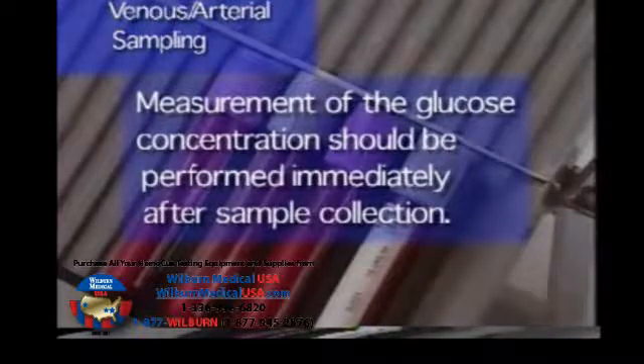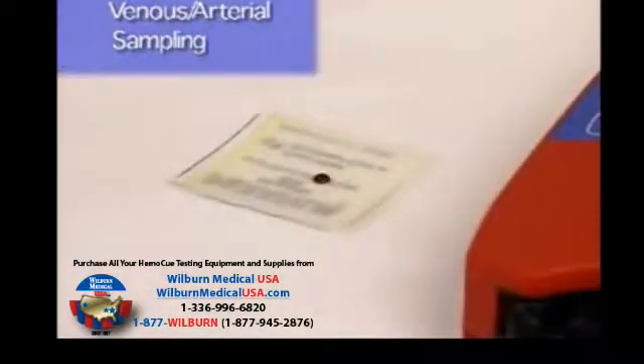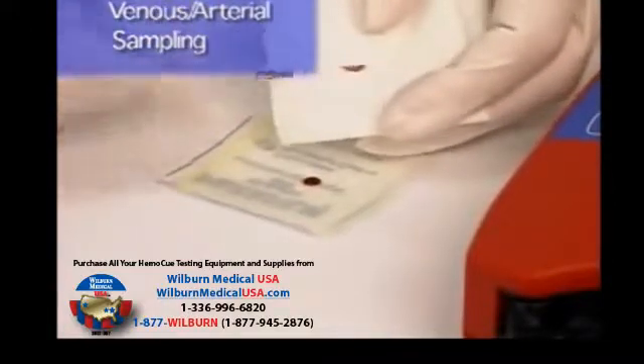Place a drop of blood onto a non-absorbent surface, for example a plastic film, using a pipette or diff-safe. Introduce the microcuvette tip into the middle of the drop so that the whole microcuvette is filled in one step. Place the microcuvette into the analyzer as previously shown.